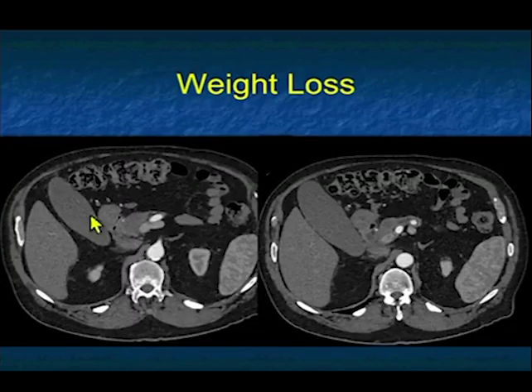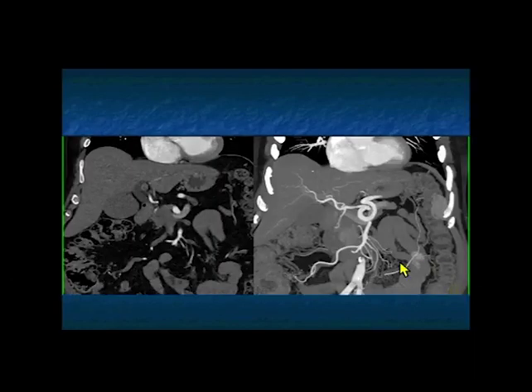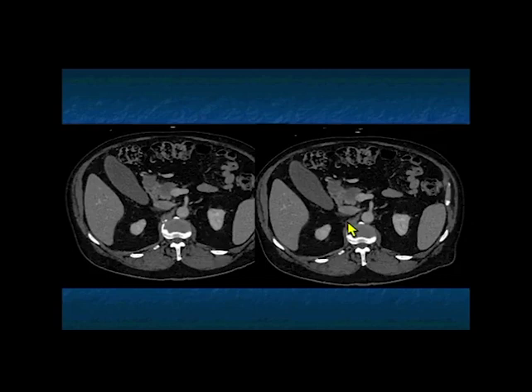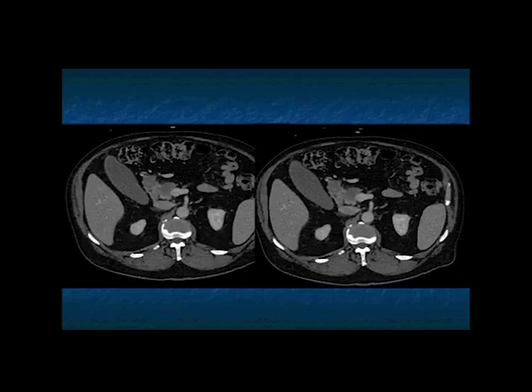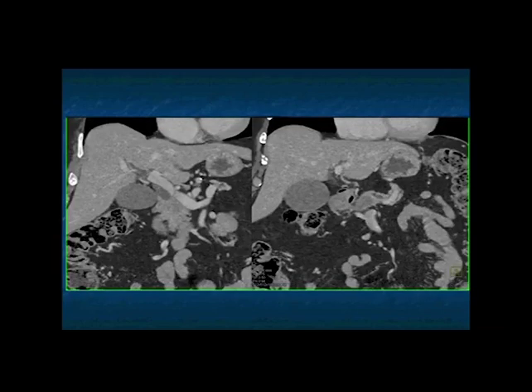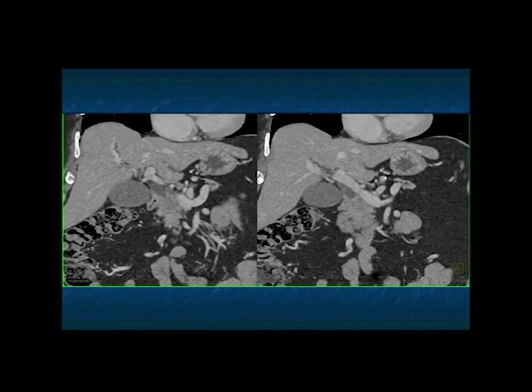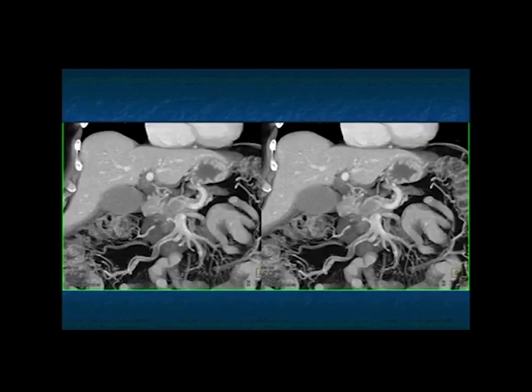Another case: weight loss. There's a dilated pancreatic duct and a subtle mass in the head of the pancreas on arterial phase imaging. On venous phase, you can see the mass a bit better along with the dilated pancreatic duct. The mass involves the GDA, but the GDA will be resected in a Whipple's procedure. There are a few small nodes nearby, but the patient would still be resectable. MIP imaging nicely shows the vessel involvement, dilated common duct, and dilated pancreatic duct.